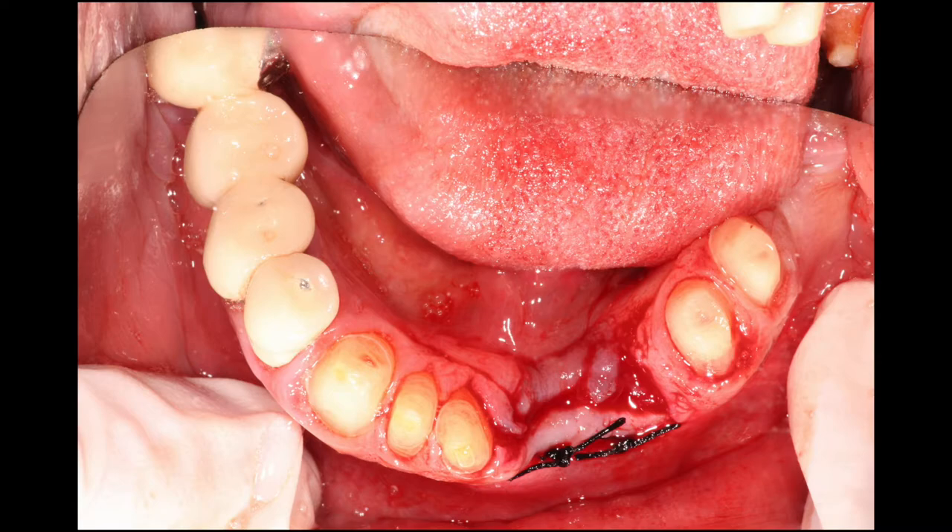This has the benefit of leaving the exposed tie-off of the stitch to the outside, and leaving the rest of the stitch underneath the soft tissue. It creates a better look, but also it's not going to get tied up inside the temporary material when we reinsert the impression.